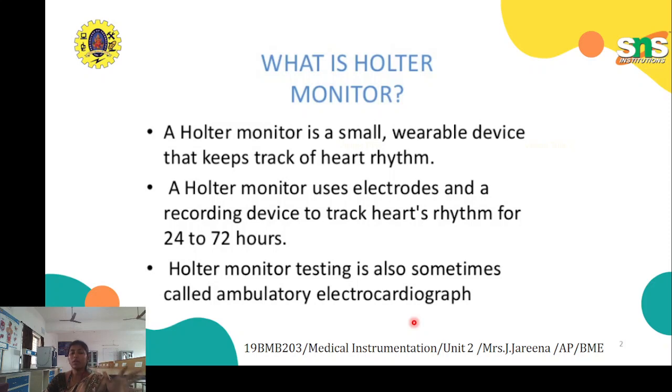So they carry out their activities, and any activity that may cause discomfort to the heart will be reflected in the recording of heart rate. In this way the doctors come to know in which activity and condition the heart may feel discomfort, so that activities can be changed and recommendations or treatment can be given, all with the help of the Holter monitor output.